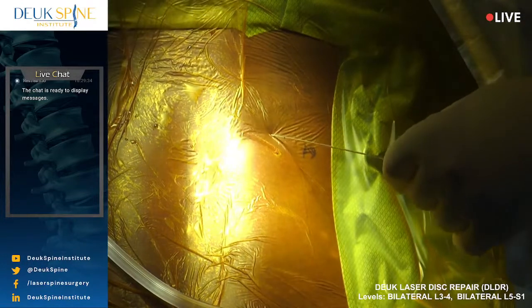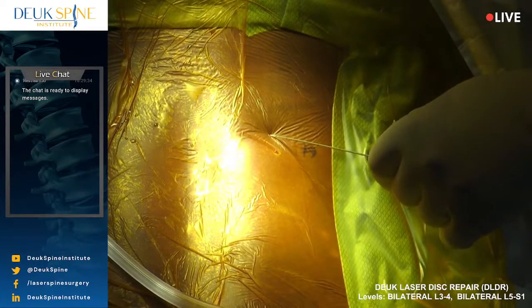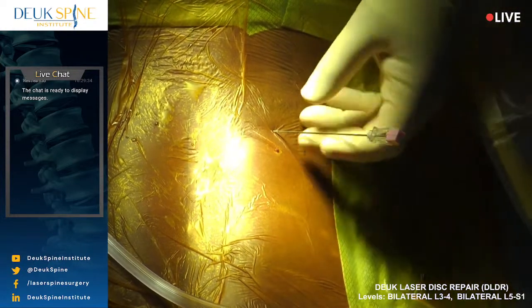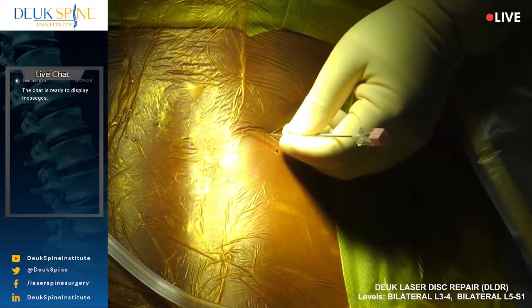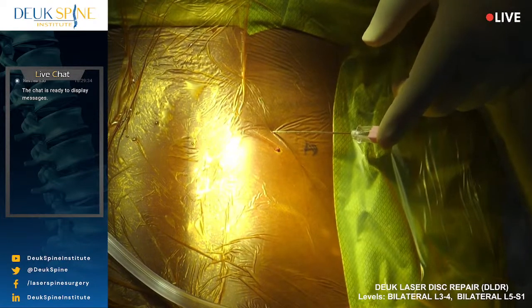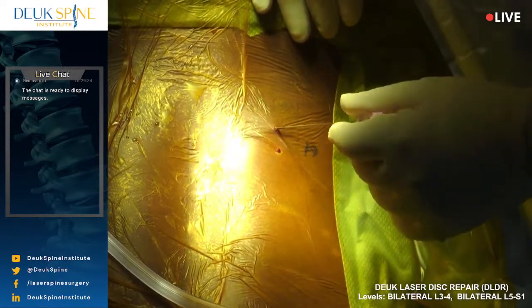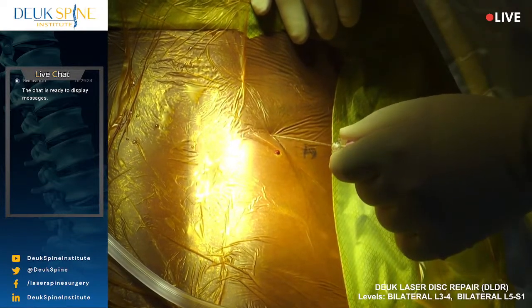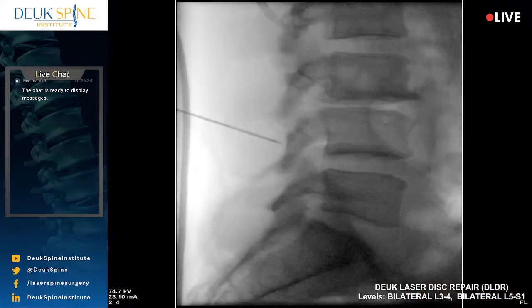You're doing a really good job laying still. Thank you for doing that. Shot. I want to get down to the 3-4. And that's going to be, I'm sorry, 4-5. That's going to be the first disc right there, 4-5. Shot. All right, so I need to be a little bit lower. Now, I can usually fix 2 discs, shot, with 1 little incision. And that's what I plan to do.